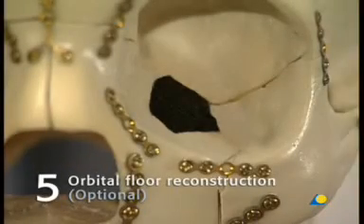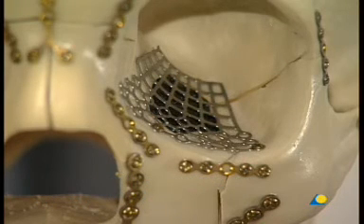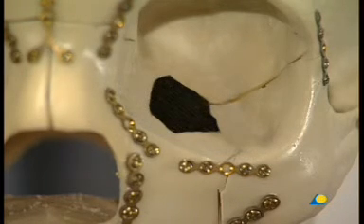In case of an orbital wall defect, reconstruction could be necessary. This model can be used for an orbital floor mesh plate, also known as a fan plate, to repair a left medial orbital floor fracture. The defect has been marked on the model.